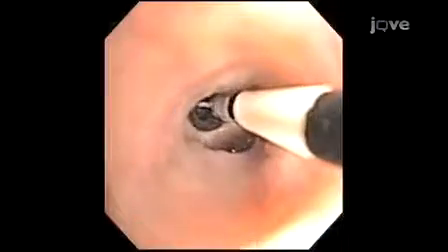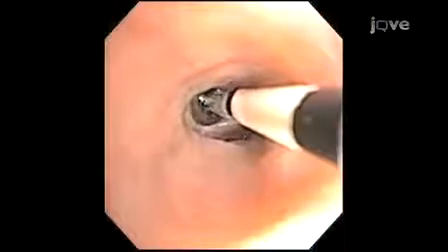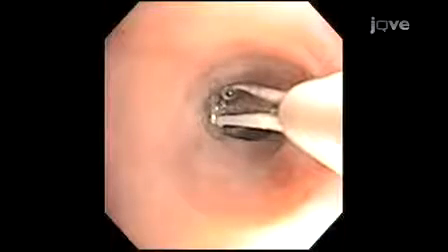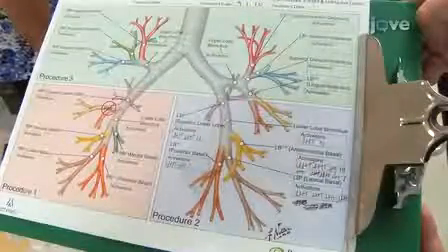Following the proposed treatment plan, the electrode array is collapsed and the tip of the catheter is moved proximally 5 mm to repeat the RF activation. 5 mm marker bands at the distal end of the catheter facilitate repositioning of the catheter. This process is repeated and subsequent activations are positioned 5 mm proximally and adjacent to, but not overlapping the previous activation site. Segments that have been treated should be recorded on a procedure form.